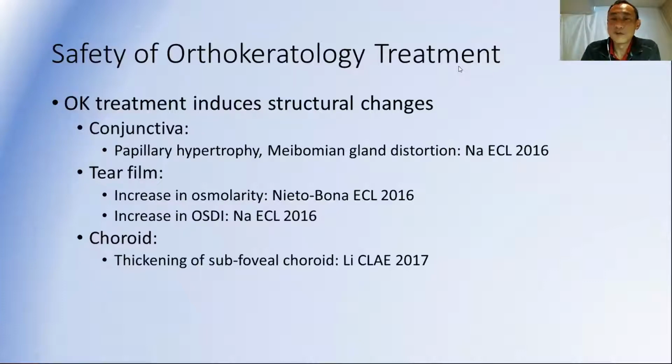If they really are uncomfortable in the office, I may put a drop in the first time that we put lenses on, but I tell them that this is not something that they can do long term. In the office, I put them in solely to be able to evaluate the lenses on the eyes, but never to help them adapt. If they just cannot adapt without anesthetic drops, then we discontinue the procedure.